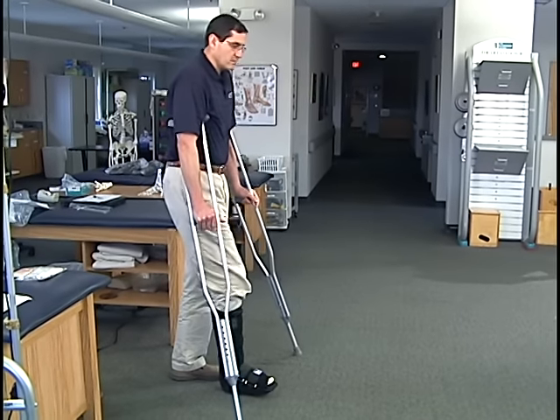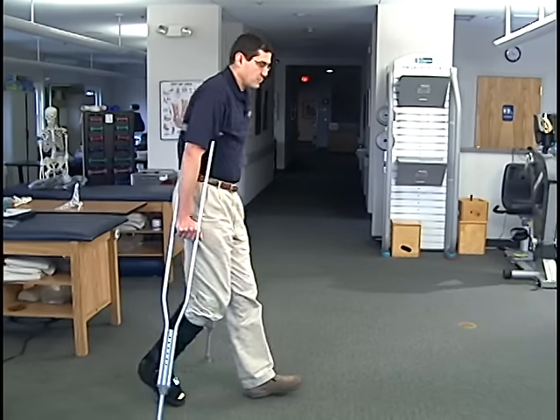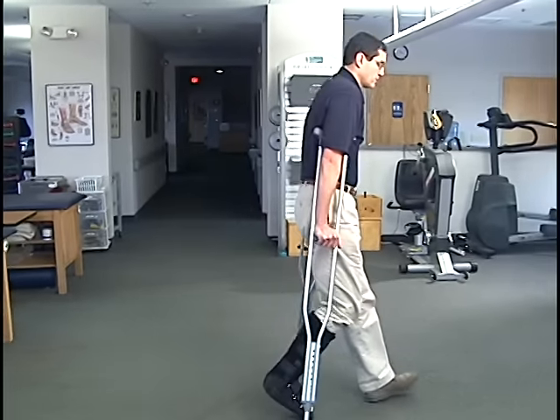Put the crutches underneath here. You're going to put some weight on your hands and some weight on your foot, approximately 50%, and you'll walk across in this manner.